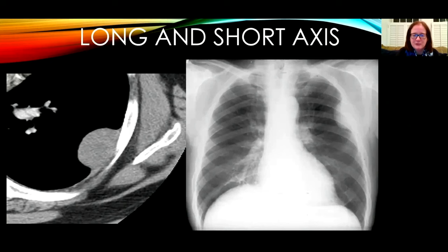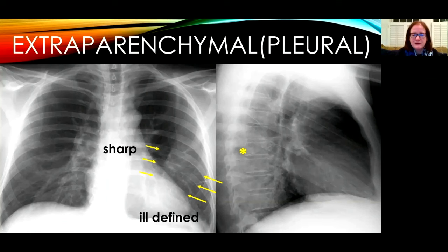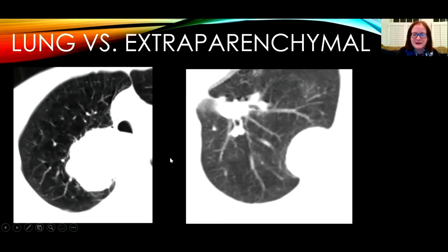Another feature of extraparenchymal or pleural lesions is that they have a distinct long axis and short axis, as seen here in a left chest wall lesion — another patient with plasmacytoma. On the other hand, lung lesions tend to have similar axes and a round shape, as seen in this patient with multiple metastatic nodules and masses. Pleural lesions sometimes have a sharp edge on one side and fade away on the other, as in this patient with a pleural lipoma that is difficult to see on the lateral view. Lung lesions tend to replace and destroy the lung parenchyma, whereas pleural and extraparenchymal lesions tend to push away and displace lung parenchyma.